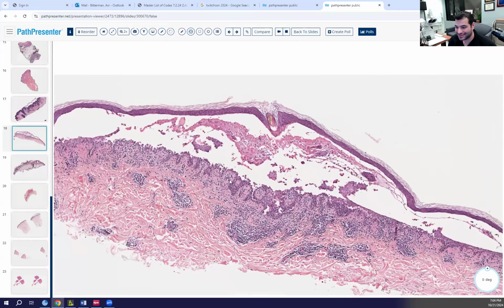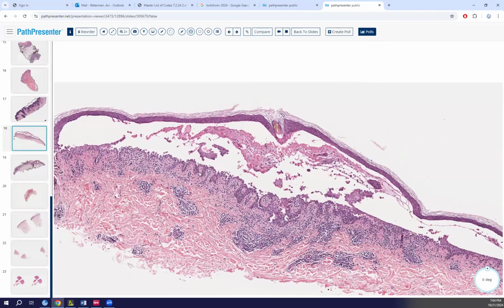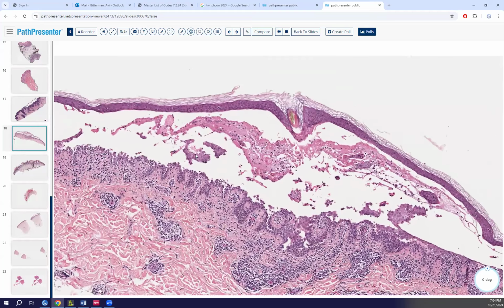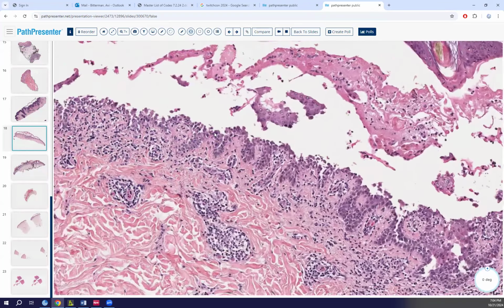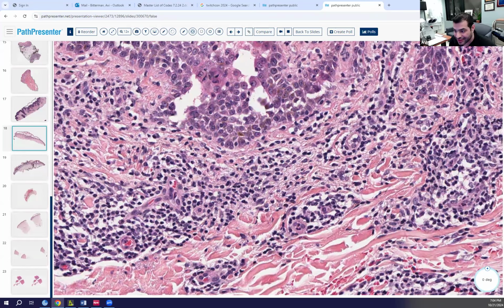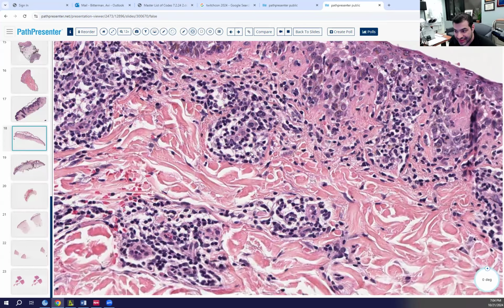What about this? This is intraepidermal again, with a superficial perivascular lymphocytic infiltrate and a lot of infiltrate in the actual bulla itself. A lot of eosinophilic material, with some... it looks as though other eosinophils. Okay, well, there is a superficial perivascular infiltrate. There are red cells here. I'm not seeing a lot of eosinophils in this case.